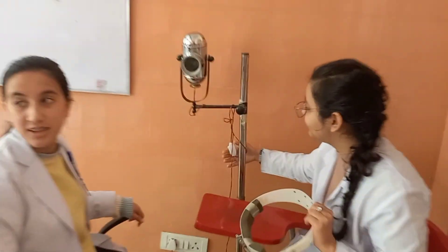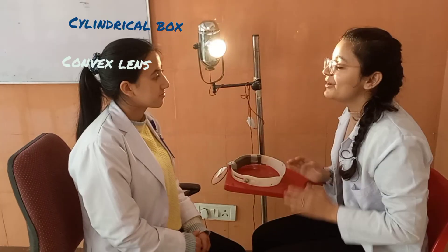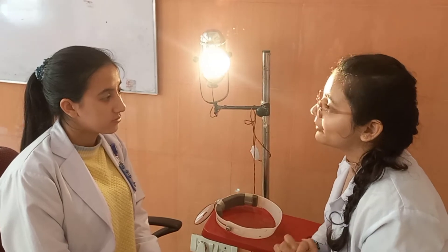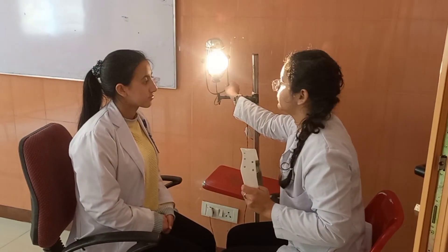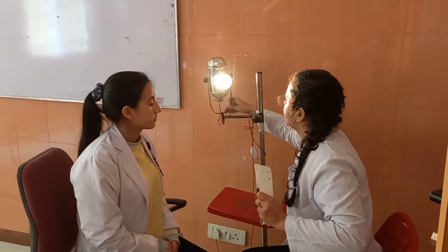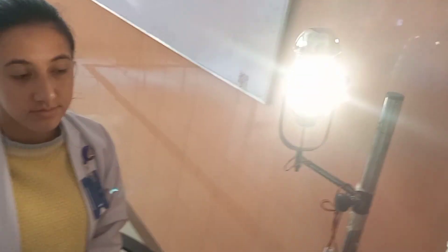I've turned on the headlight using the switch. Remember, do not touch the cylindrical box or your hand will burn. Always start by taking consent from the patient — here I'm taking consent from my friend. While taking consent, you can switch on the bull's eye lamp and arrange the patient's position. The patient should be at one arm's distance from you, and the bull's eye lamp should be at an equal distance, at the level of the patient's ear or shoulder.